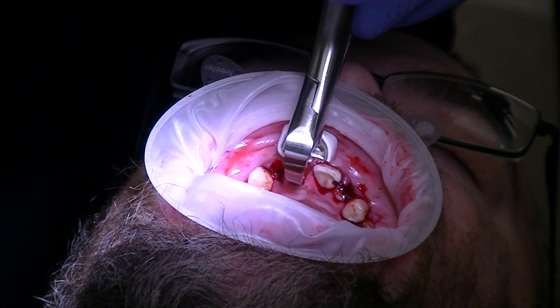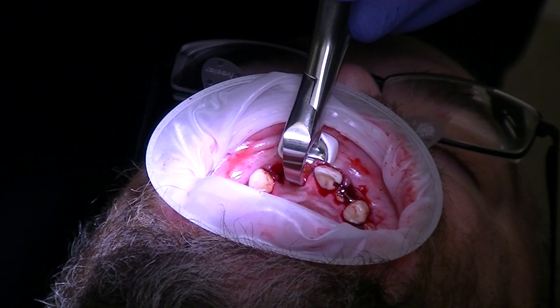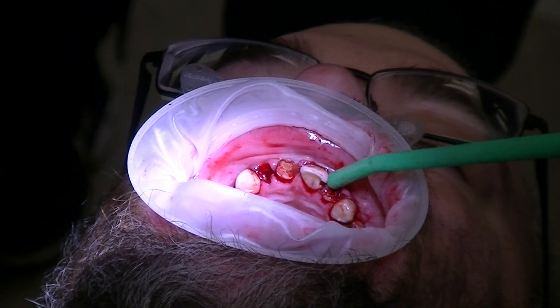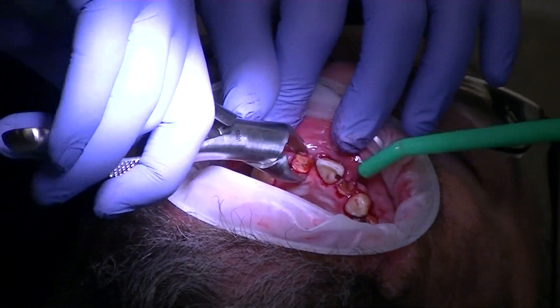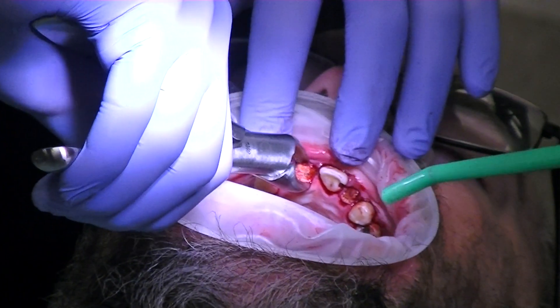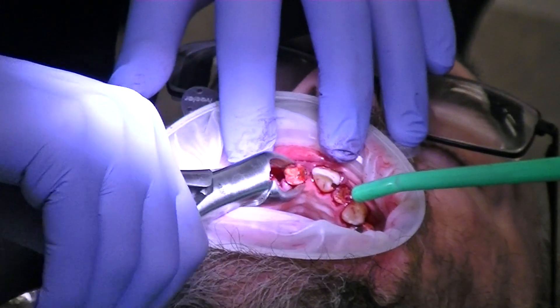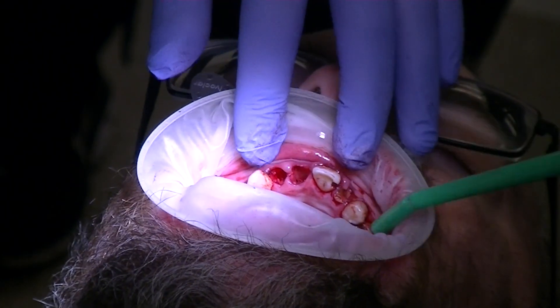We let our patient know he's going to feel a little pressure. Does he feel pressure? No pain? Even better. Everybody see the movement right there. I'm not going to go more than 20 degrees — it's loose — so I'm going straight back to my 150. You can also use the tooth delivery. Remember I'm not going buccal-lingual; I don't want to break the buccal plate. I'm the implant guy — I want to preserve as much bone as possible. Just twist.